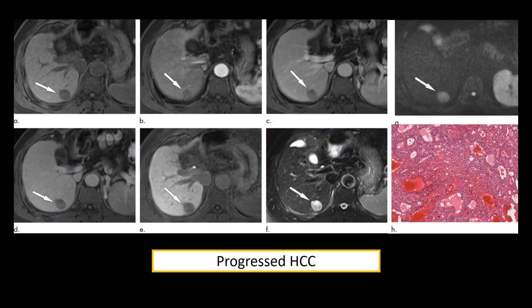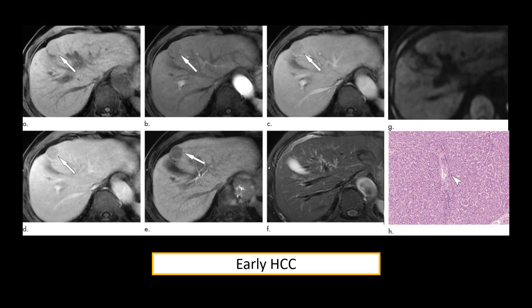In a case of progressed HCC, the nodule is T1 hypointense with no significant arterial hyperenhancement, but shows portal and delayed phase washout and hypointensity on HBP. It is T2 hyperintense with diffusion restriction. By contrast, in early HCC, there is no T2 hyperintensity, no arterial hyperenhancement, only subtle washout in portal and delayed phase, and well-defined hepatobiliary phase hypointensity — with no diffusion restriction.